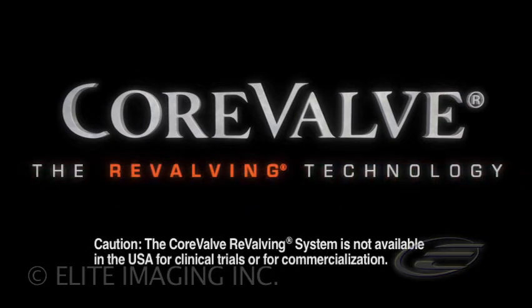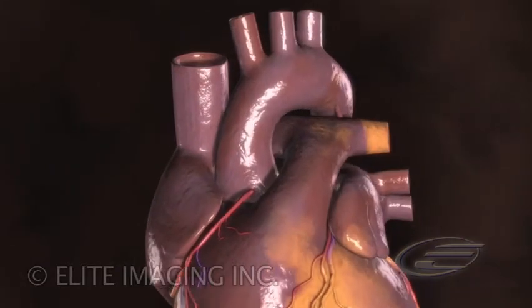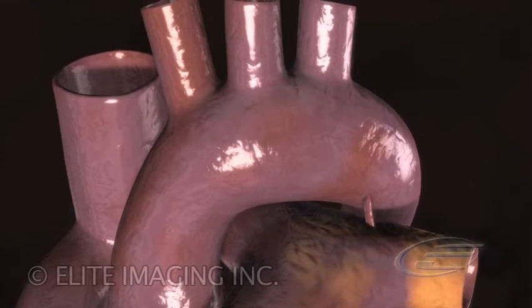The CoreValve revalving system transforms an open-heart surgical aortic valve replacement into a percutaneous beating heart interventional procedure performed under fluoroscopy in the cath lab.